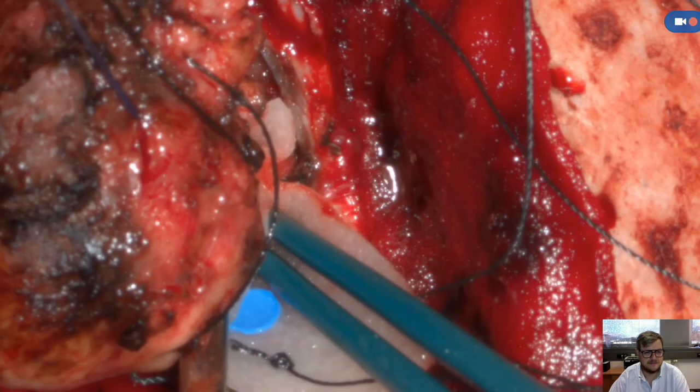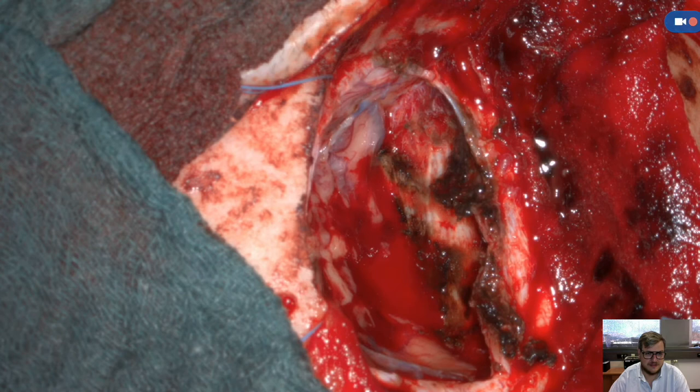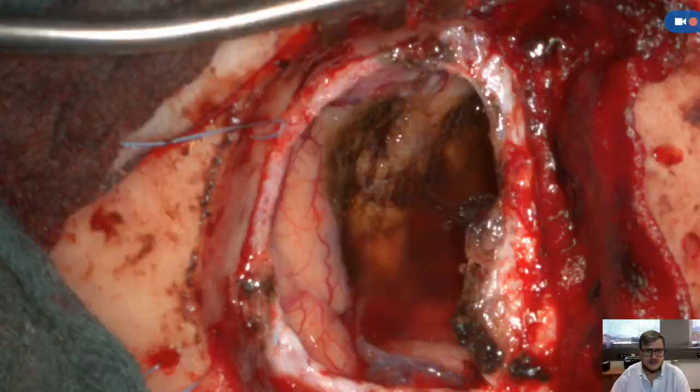Now the tumor is resected completely. You can look into the cavity, you see the falx in the middle, the brain retracted by the tumor. And this is the kind of final view of the hemostasis.